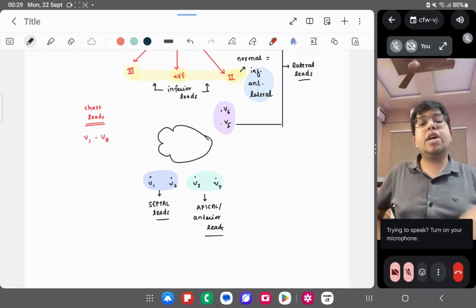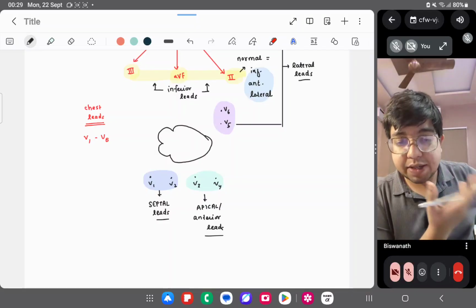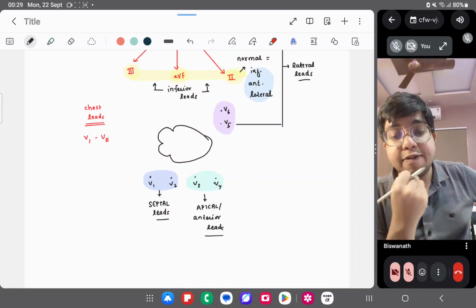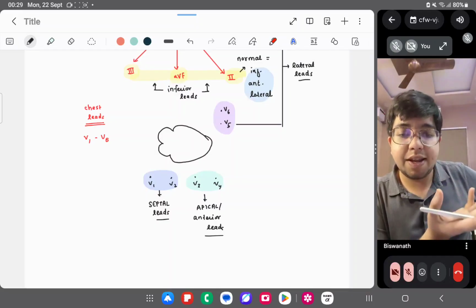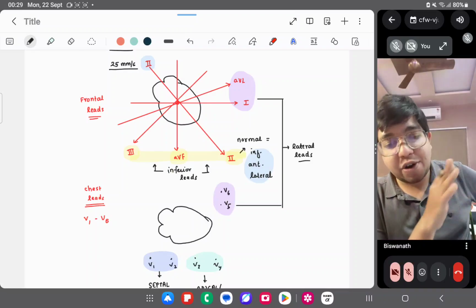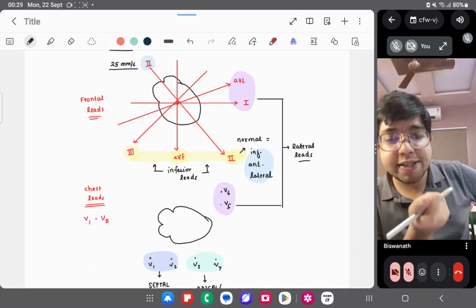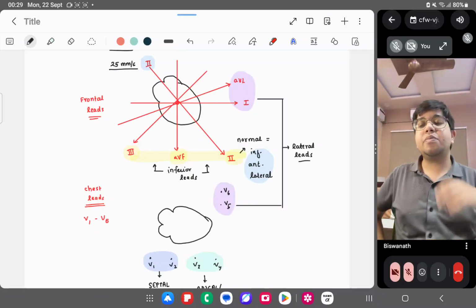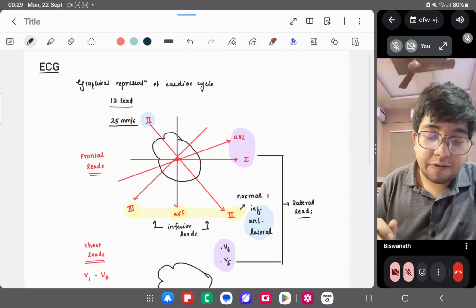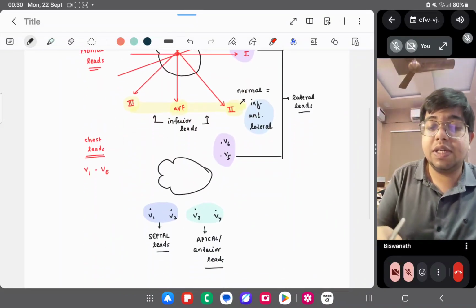Which of the leads visualize the apex of the heart? Which of the cameras, I can say, in heart terms. Apical leads are basically V3 and V4, so V3 and V4 are contiguous leads. Likewise, AVL, 1, V6, V5 are all contiguous leads. 3, AVF and 2 are also contiguous leads. Understood. So that's all in today's session of graphical things. We saw from the graph.